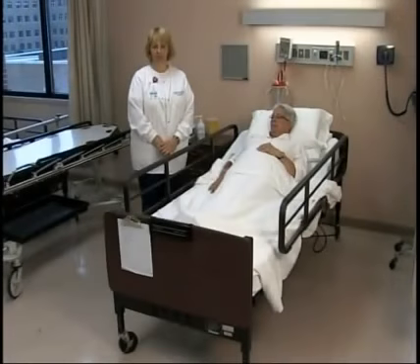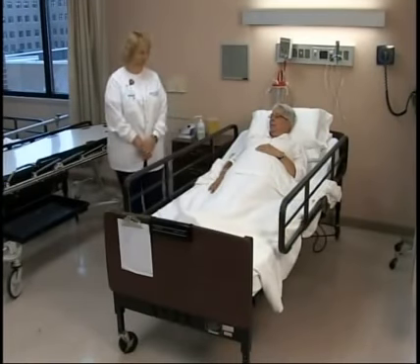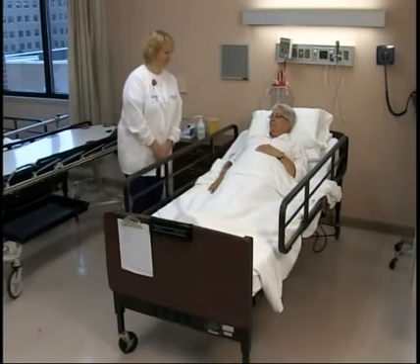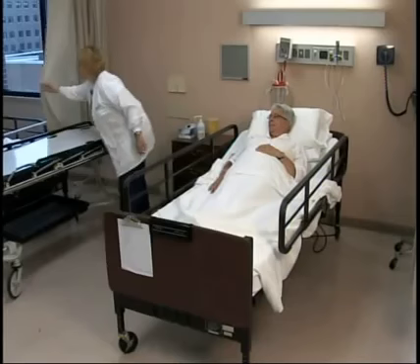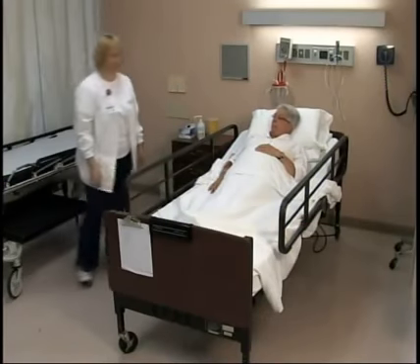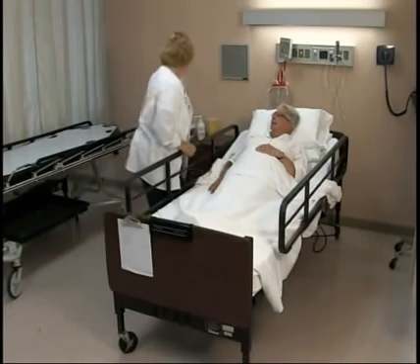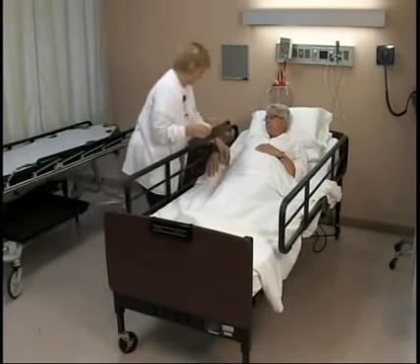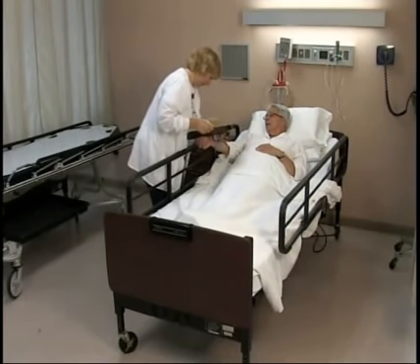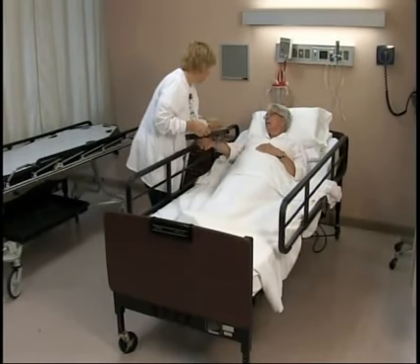Now the skill validation for bed to stretcher. Wash your hands before entering the patient's room and provide for privacy. Introduce yourself to your patient and explain what you will be doing. Check the name and patient ID number with the order sheet and verify the order. Read and compare ID name and number out loud and ask the patient their full name.